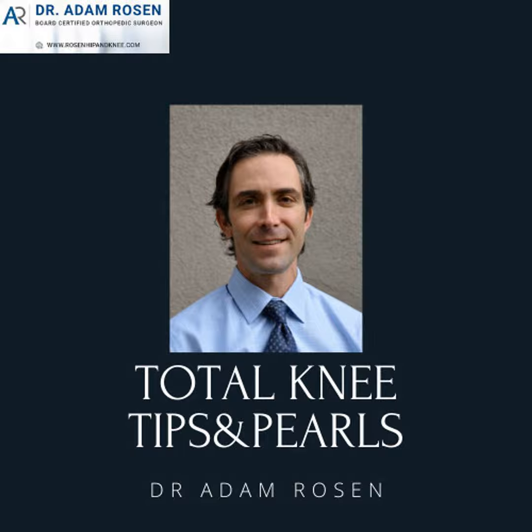However, there's a lot of studies that have shown that surgeon's judgment is very important. So if I have a normal sed rate and CRP, but when I'm in there, things don't look right, then I will take fluid and I will take tissue and culture, but always take at least 3 and always take an odd number.